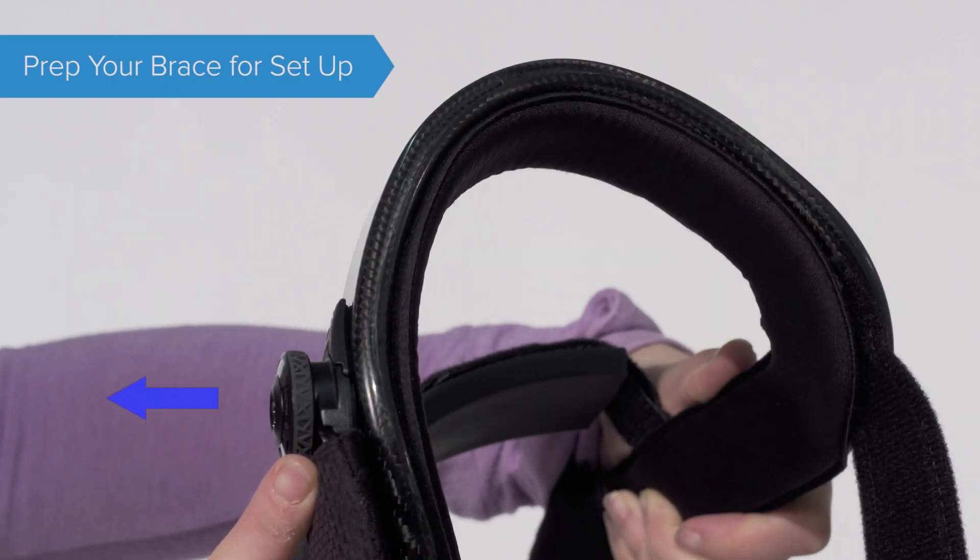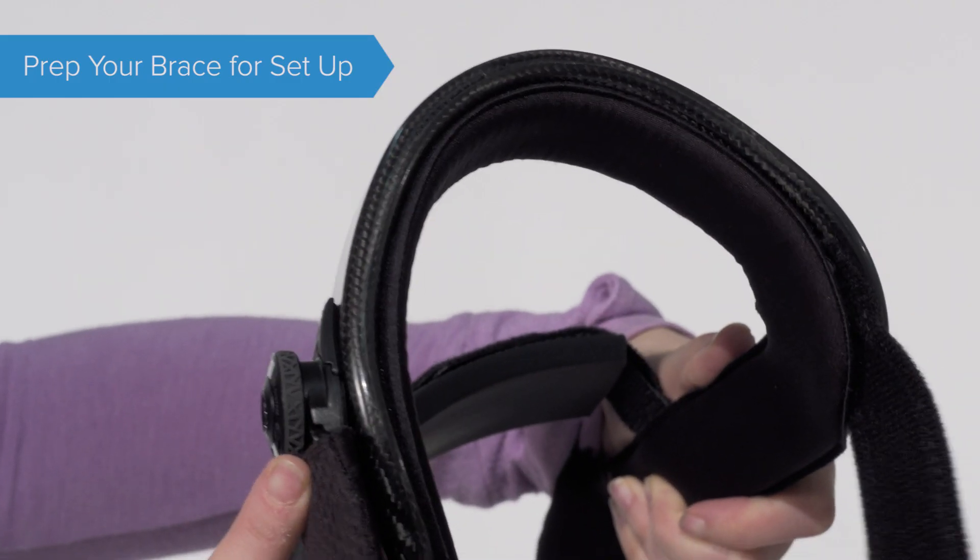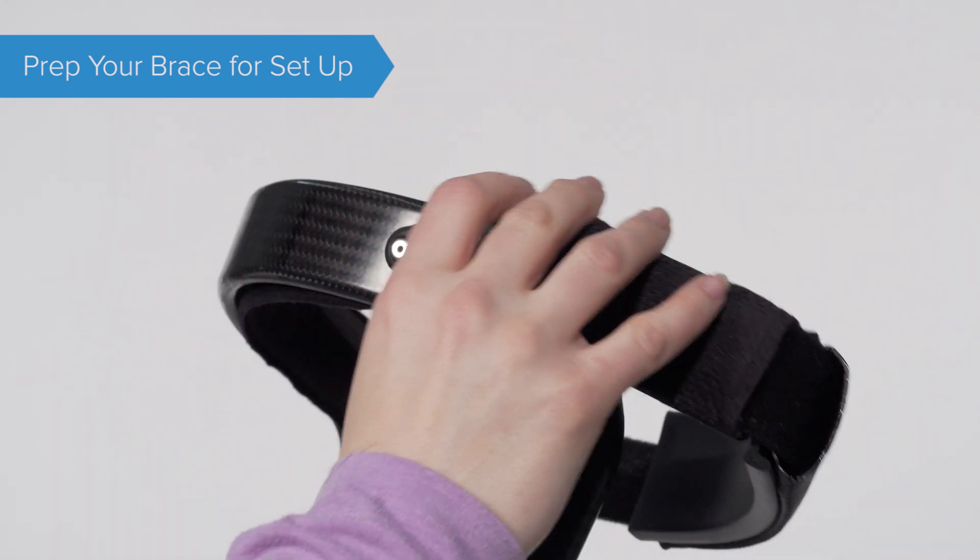Pull the tensioning knob up until you hear a click. Lift the strap at a 45 degree angle and pull away from the brace frame.